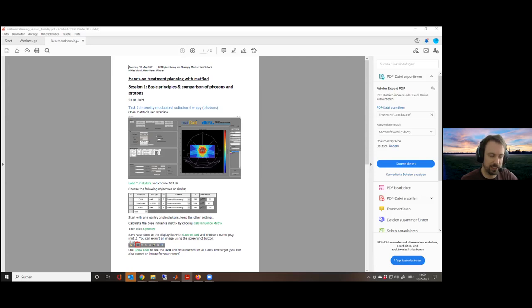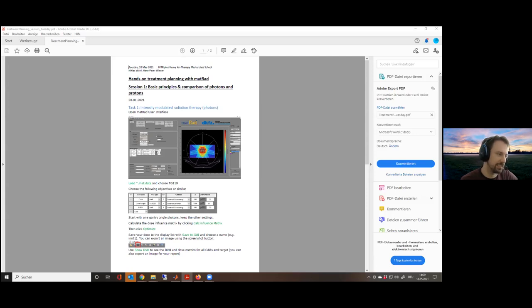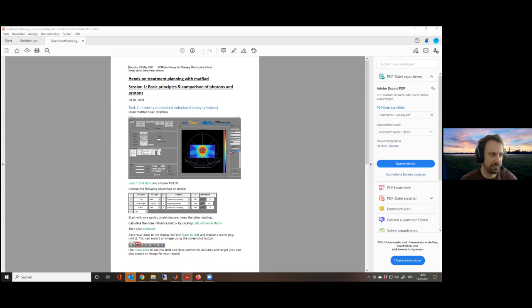If you use Octave, you cannot work from the interface. In principle matRad can completely run in Octave, but the display and user interface are not there. If you start it, you will get an error because Octave does not support the user interface.